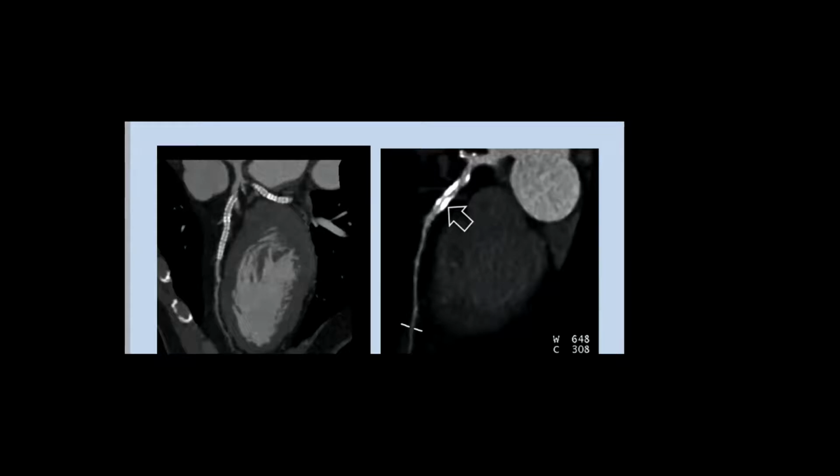What about the one on the left? Sorry, again? Stent. Exactly. Stent. These are stents. Okay? In LAD and circumflex. Exactly. Yes. So what's the problem? Are we going to do CT for stents?